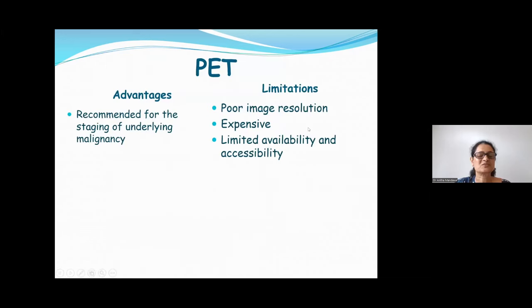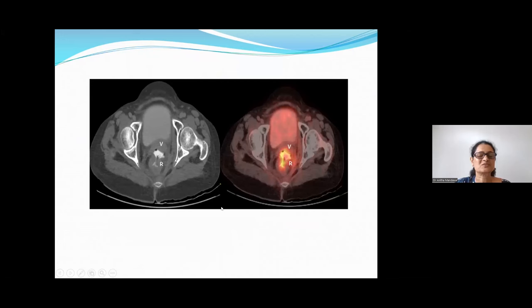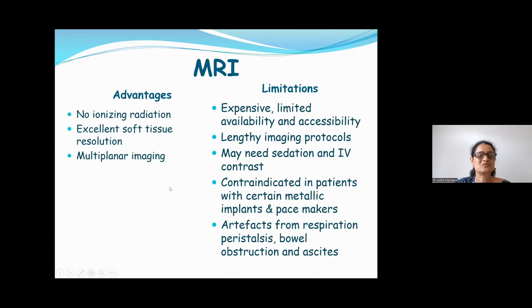PET is recommended only for staging of malignancy and has poor anatomical resolution, but occasionally during staging it can accidentally reveal a fistula — here showing a nice rectovaginal fistula. MRI is not advised for all patients because they cannot hold contrast for long, there are associated artifacts, and imaging protocols are long. However, MRI is indicated in specific cases.